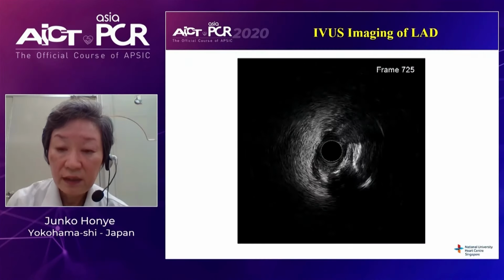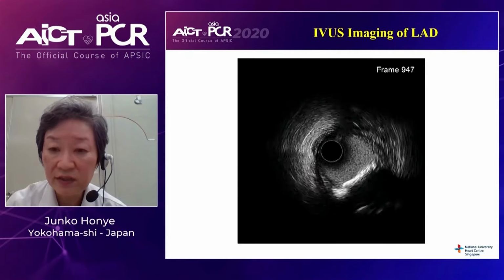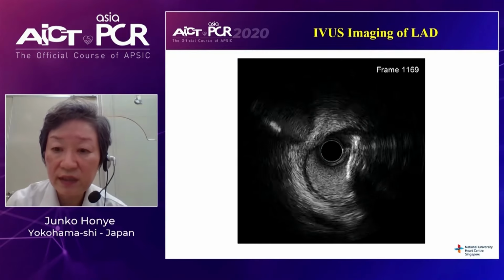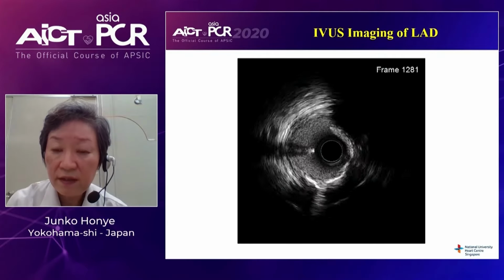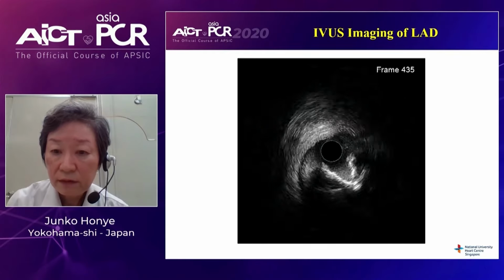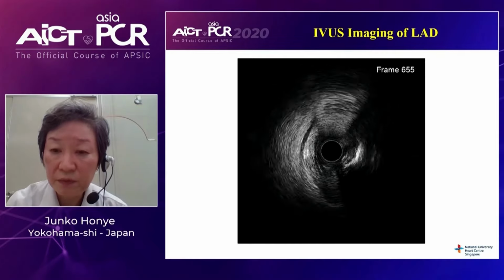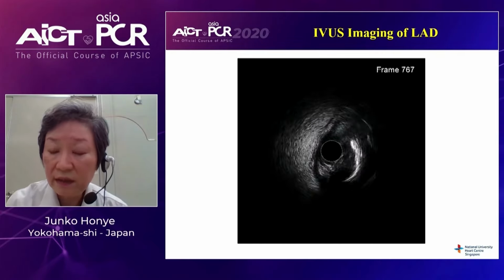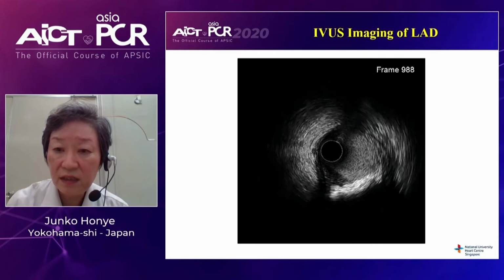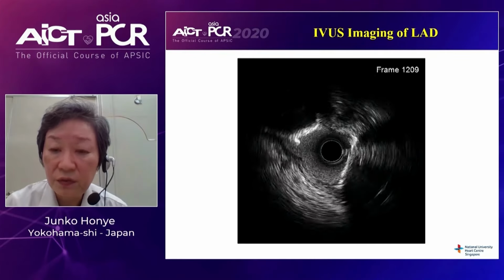Okay, thank you, Dr. Tam. Okay, you can see the IVUS image, and you can see the calcium on your right-hand side. But it is located eccentrically, not circumferential. So once you create a dissection with the NC balloon, then that lesion would be nicely expanded following stent expansion. And this calcium, the surface is very irregular, so that calcium is probably very thick. However, on the opposite side, a very healthy area can be seen. And so in that case, the pre-dilatation is important. And of course, you don't have to use a rotablator.